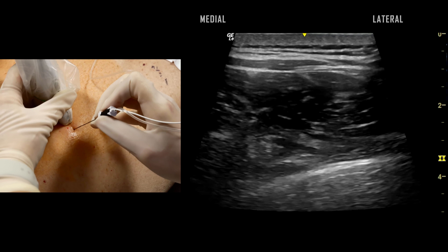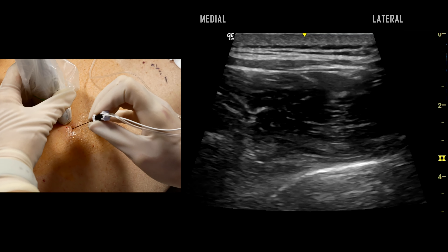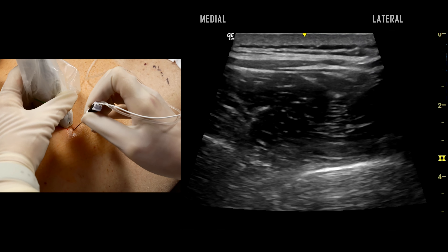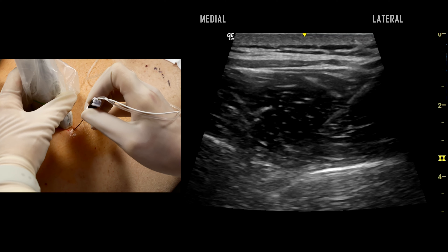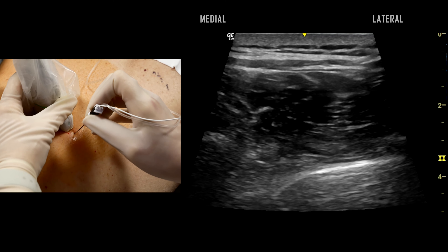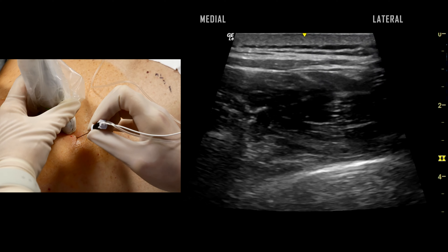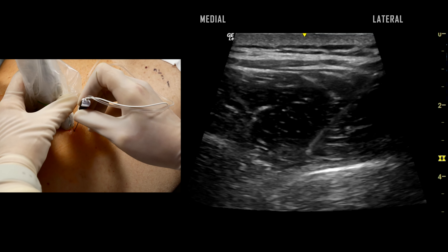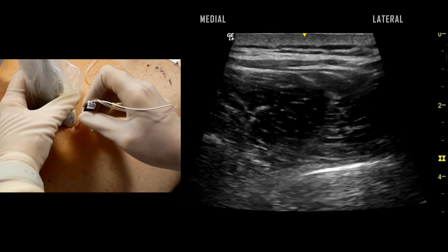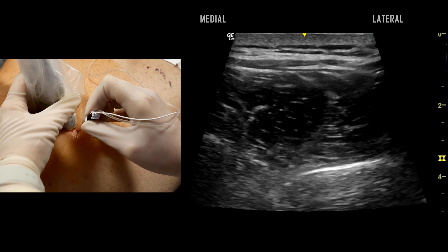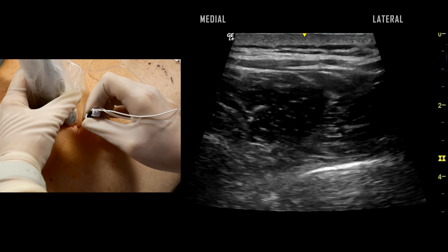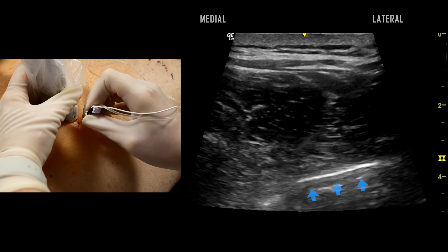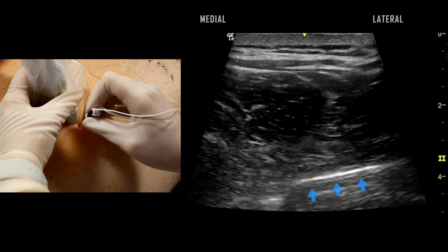The block needle is then inserted and visualized in-plane with a lateral to medial trajectory to penetrate the superior costotransverse ligament. A subtle pop or crunch may be elicited. Careful aspiration and injection of local anesthetic in aliquots will show depression of the echogenic pleura away from the needle.